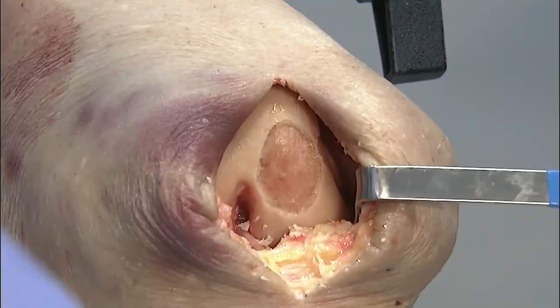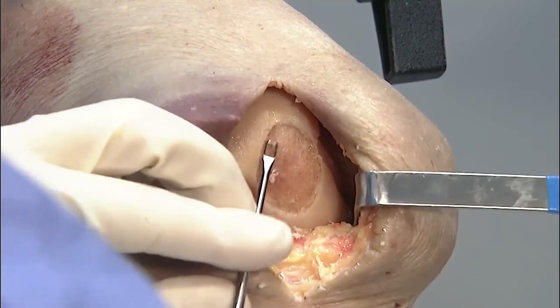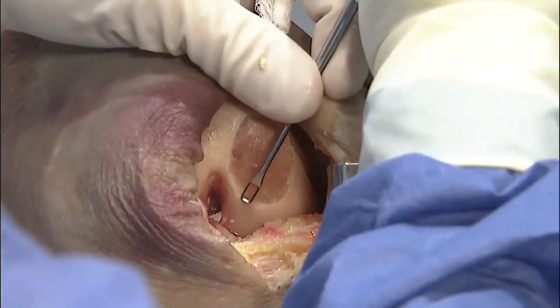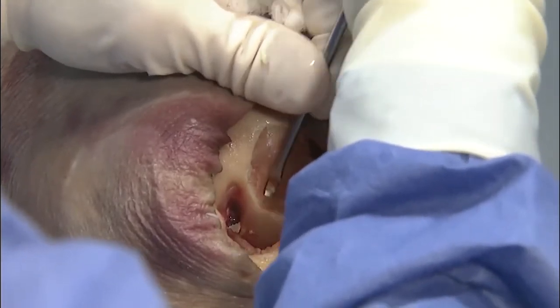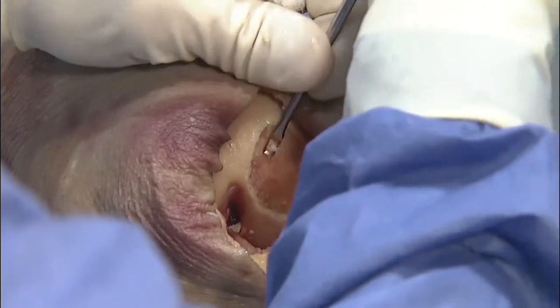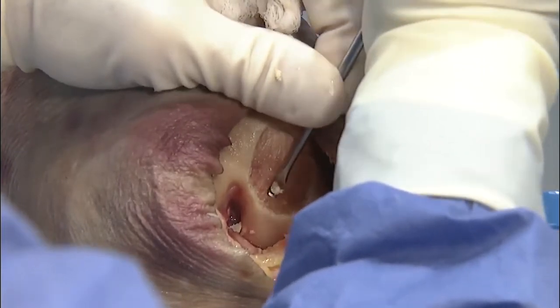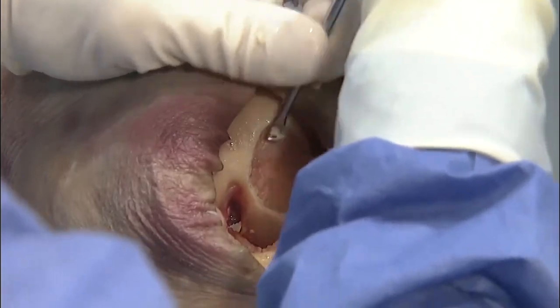But if you're having trouble identifying the layers, when you still have that kind of milky white glassy surface, that's probably the calcified cartilage layer still at that point. Yeah, and I don't know if you can appreciate the sound here, but you can hear when you still have that little grizzle. That's your calcified cartilage layer, and then when you lose that sound, then it's gone. So that's something I teach the residents and fellows. But you can still hear it there. I don't know if you can appreciate that in the room.